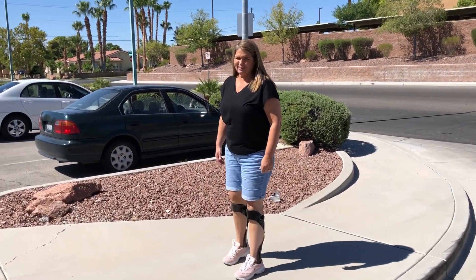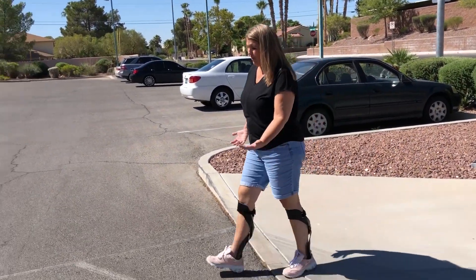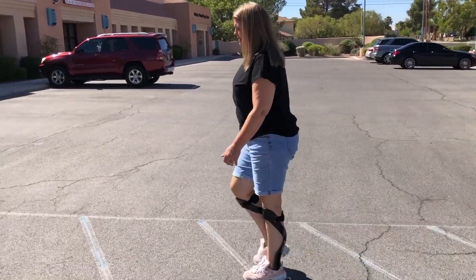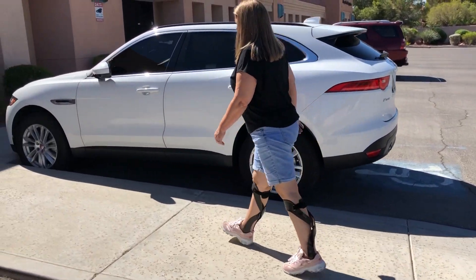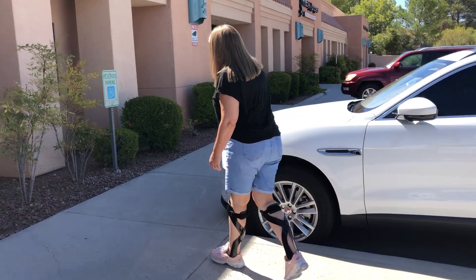How does the alignment look? It looks very good. It feels amazing. How does your knee feel? It feels fine — no more hyperextension. It doesn't feel hyperextended at all. My walk is effortless. I actually really like the plate coming underneath my toe.